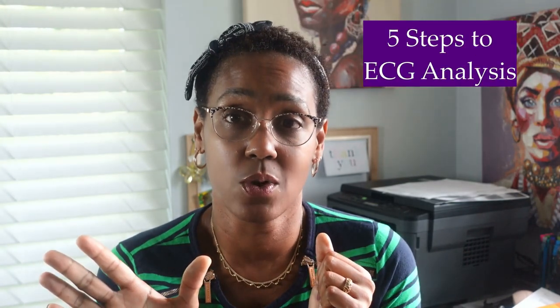Today we're going to talk about the concept of ECGs, electrocardiograms. If you are starting your med-surg courses in nursing school, you are going to need to learn how to read rhythms. Or maybe you're a new nurse starting in the tele unit or the ICU. Don't worry, I got you. I'm going to show you how to interpret ECGs in 5 easy steps, okay?